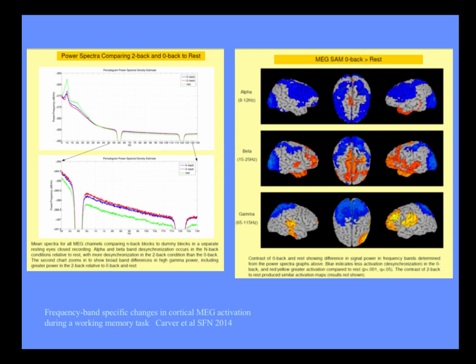This is now the high gamma that we're starting to look at a lot. If you very carefully map out these higher regions, this is 2-back, 0-back, and resting. And you can see that out here, this is a much higher frequency. We're actually looking at 65 to 115 hertz, where you get reliable task-related gamma differences. Now, this is the kind of thing that you can't resolve at all with fMRI, because you don't have that component to your data to be able to look at. So here's a very specific time-oriented process that you can't see with other functional methods.